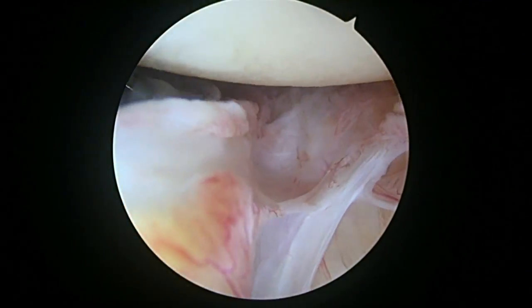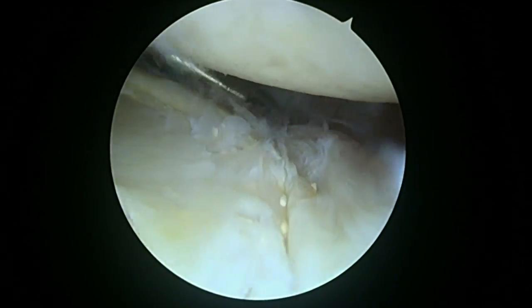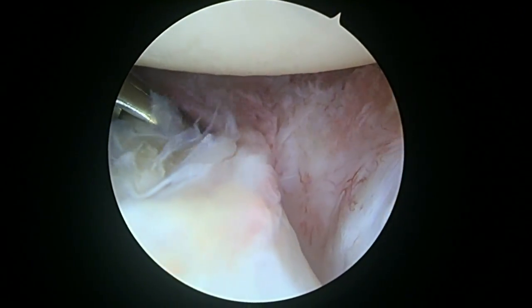I'm going to look down the front. We're going to put the scissors in the front in a minute — I just want to see how far we need to get. Sometimes we can even make a little starter hole here.